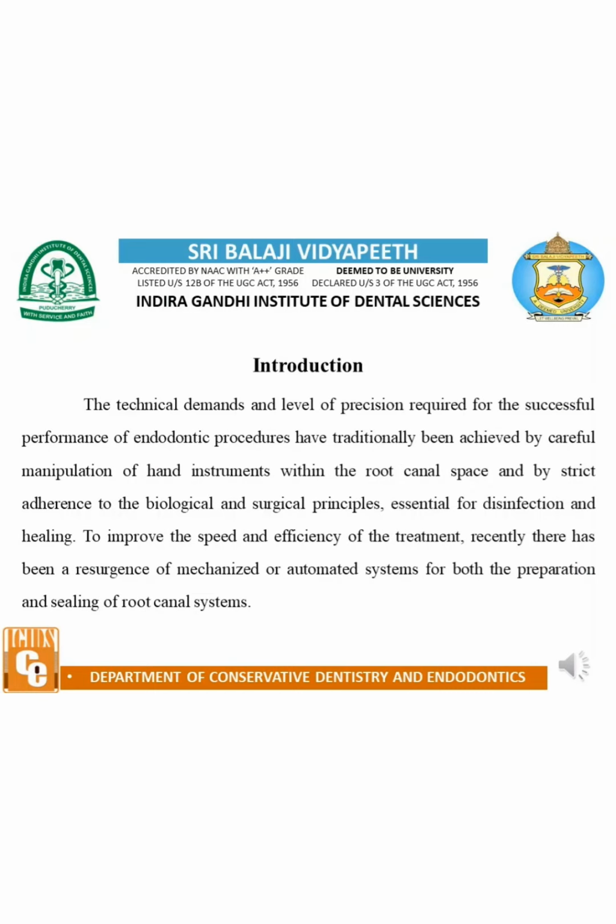Introduction. The technical demands and the level of precision required for the successful performance of endodontic procedures have traditionally been achieved by careful manipulation of hand instruments within the root canal space and by strict adherence to the biological and surgical principles essential for disinfection and healing. To improve the speed and efficiency of the treatment, recently there has been a resurgence of mechanized or automated systems for both the preparation and sealing of root canal systems.